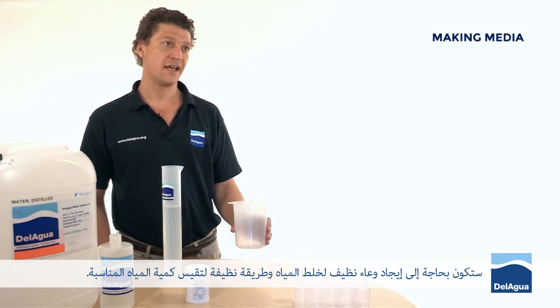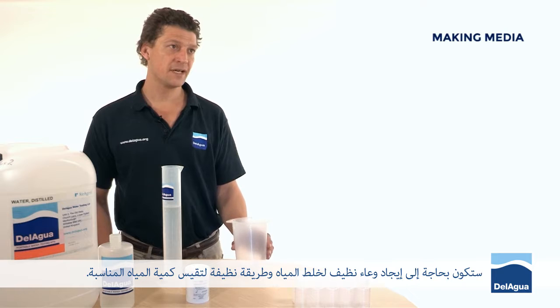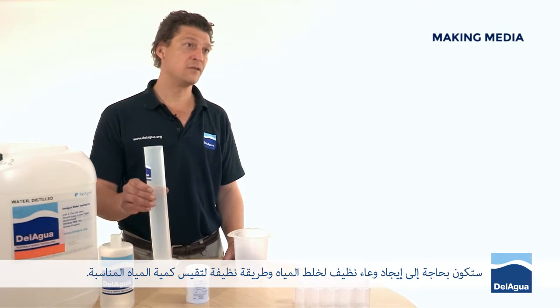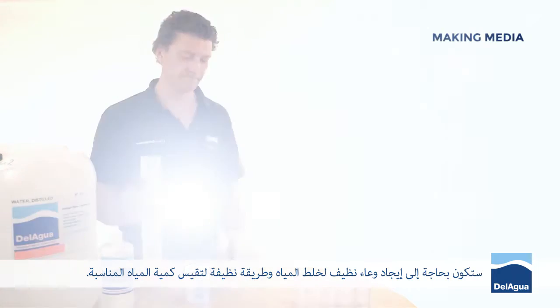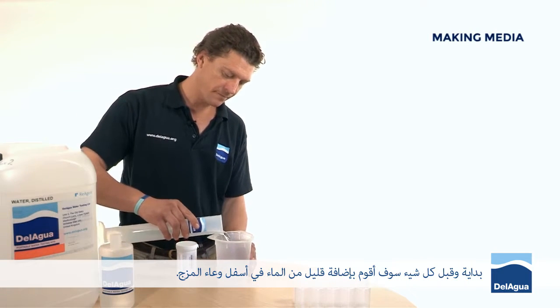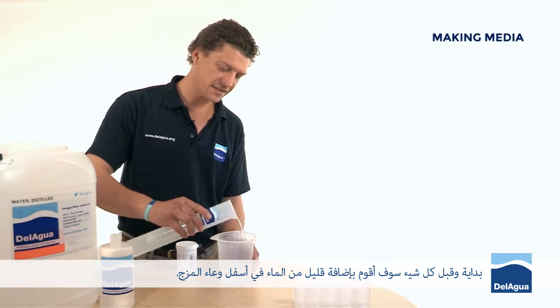You're going to need to find a suitable clean mixing container and a suitable clean way to measure the right amount of water. First of all, I'm going to add a little bit of water to the bottom of the mixing container.